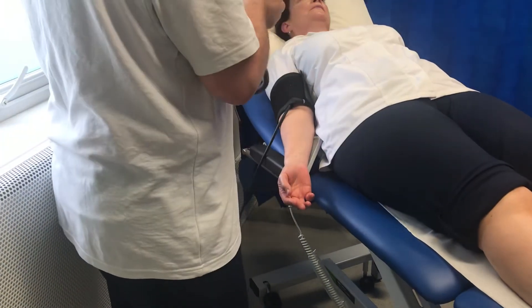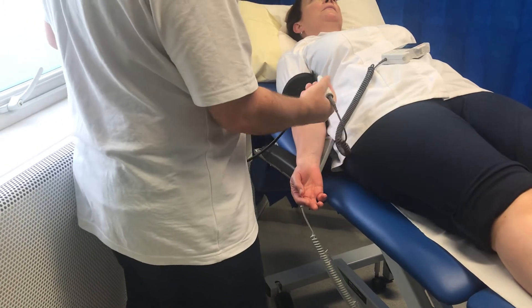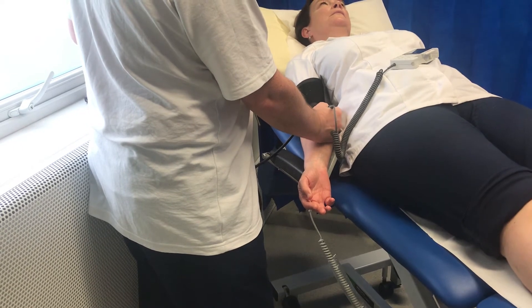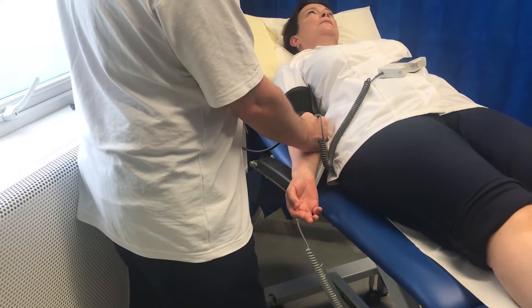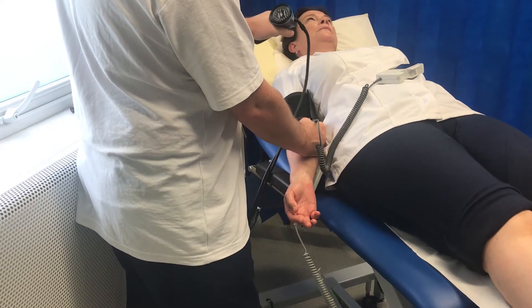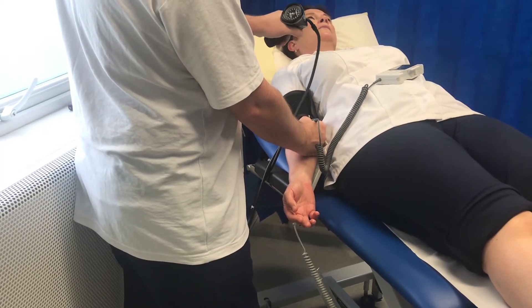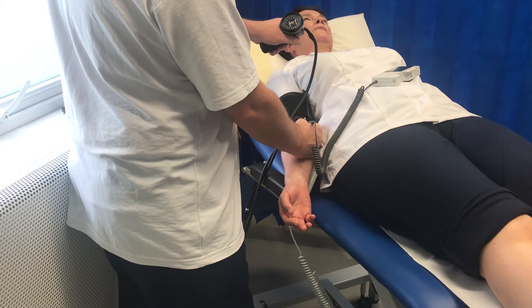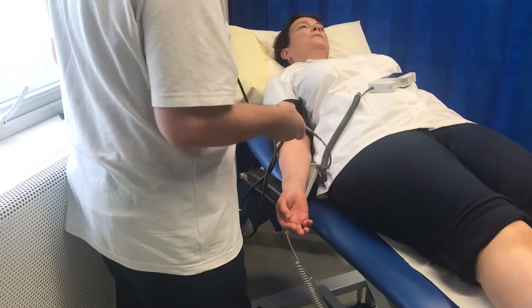So again, I'll explain to the patient I'm taking a blood pressure on this arm. This time I'll demonstrate the brachial pulse. I'll go to the elbow and slide across the elbow crease until I find the pulse — there's a nice loud one. I'll anchor to the patient's arm, close that valve, deflate, one more inflation after the last sound goes, get my finger on the trigger, and deflate slowly. I'll make a mental note of when the pressure came back in.